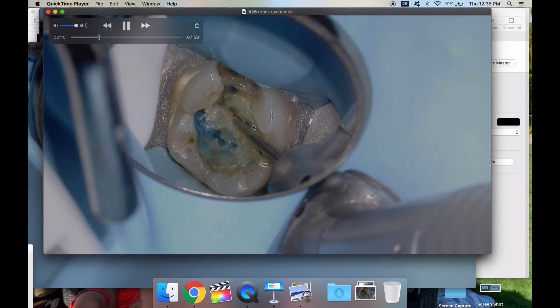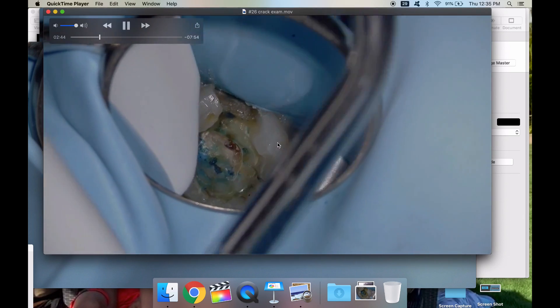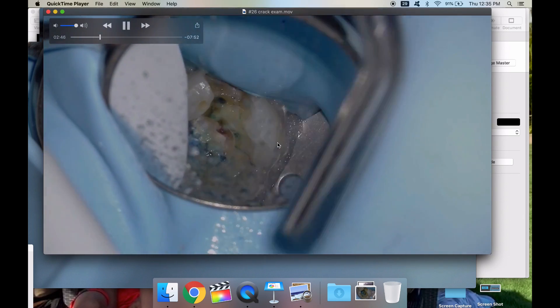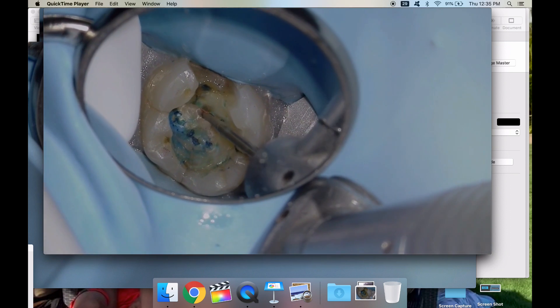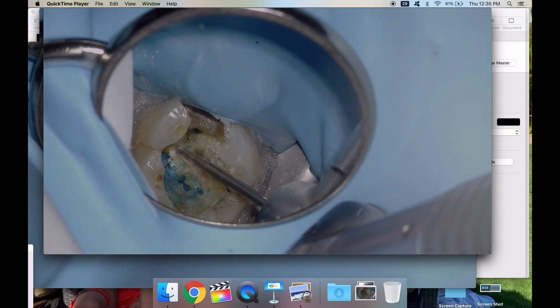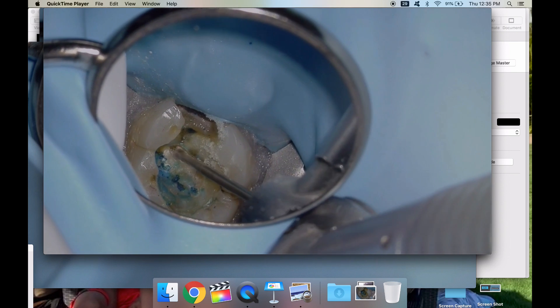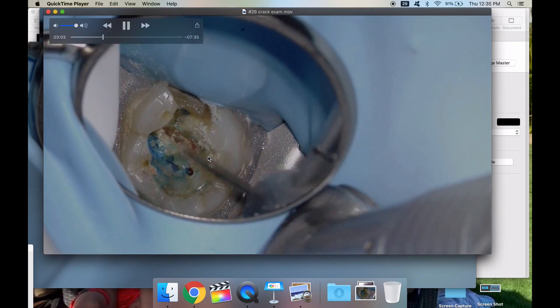You can see how close we were to the pulp chamber. Honestly this patient would have been in a lot of pain afterwards. Her symptoms were very simple — cold sensitivity before this restoration was removed, and it was removed because there was decay around it. She still had cold sensitivity prior to being anesthetized to remove the filling.